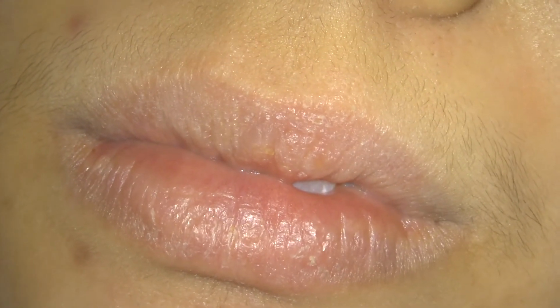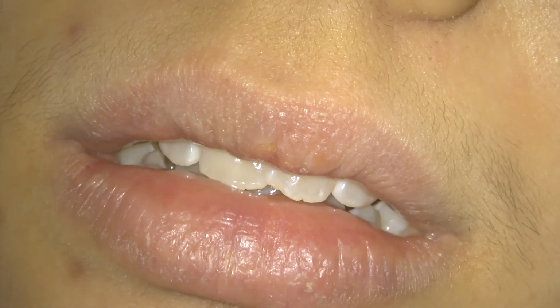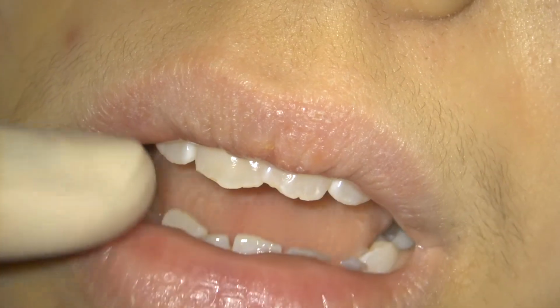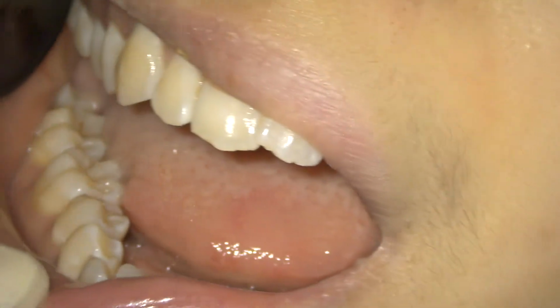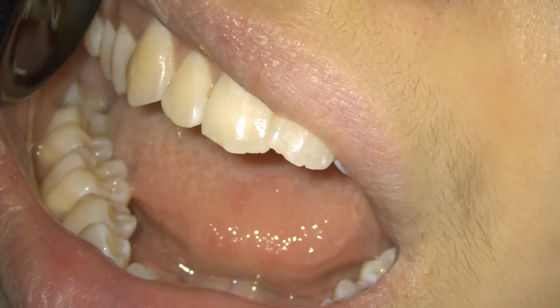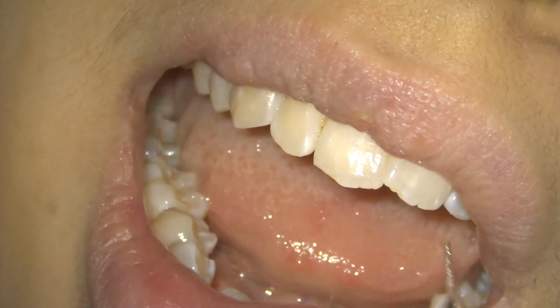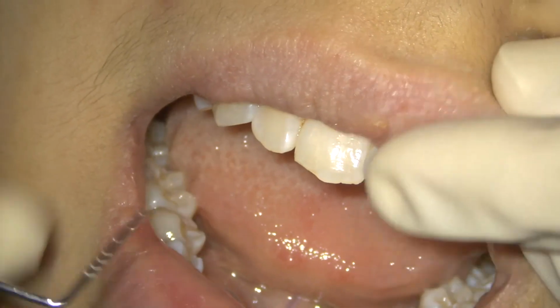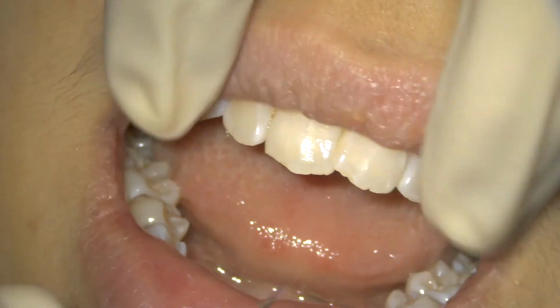So how to assess bleeding in the patient? For this, of course, you normally do a full mouth bleeding score. So you usually assess all the surfaces. You retract the cheek of the patient. You start from the distalmost point usually, which is the molars, and then you go onto all the facial surfaces like this. When you are doing that, you have to run the probe, which I will show you now.